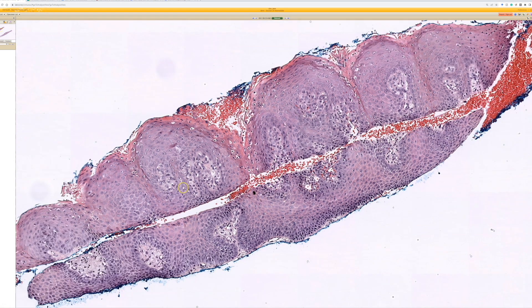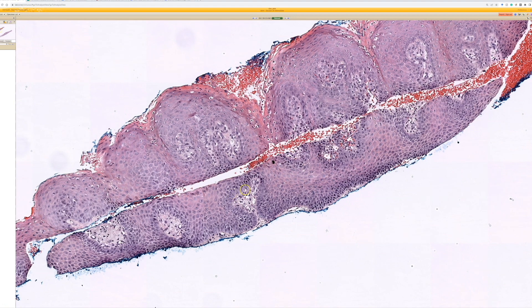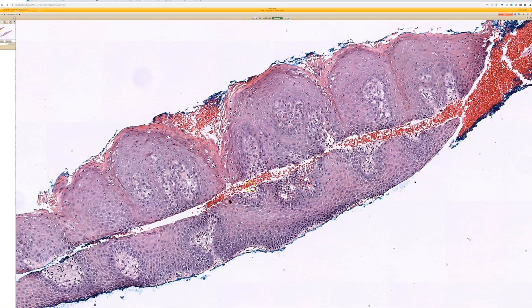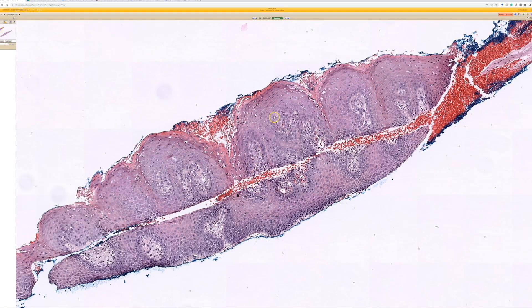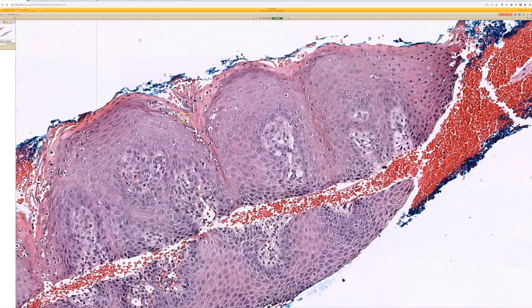So always go looking for the foam cells. The anogenital area and the oral cavity are the two most common areas to see verruciform xanthoma, and they often have neutrophils in the stratum corneum — good thing to know about.